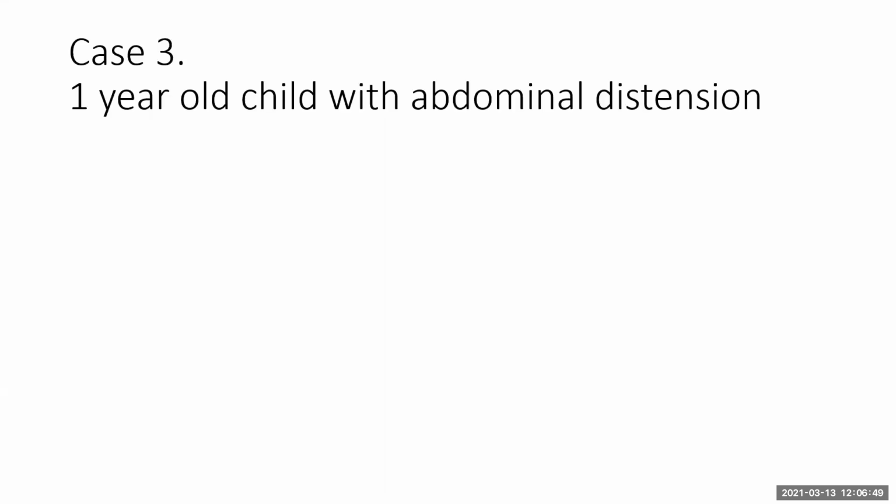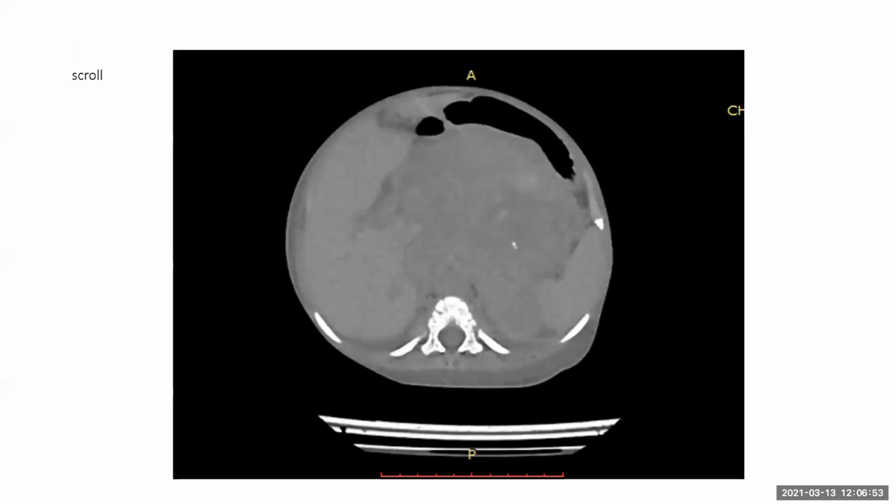Okay. So the next case is a 1-year-old child with abdominal distension. Okay, ma'am.